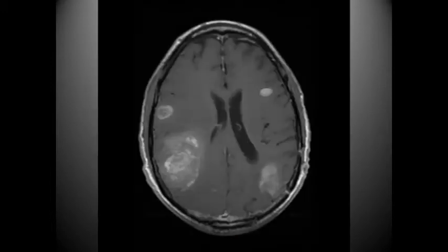Here's another example of brain metastasis with large areas. And another thing that you look for in brain mets, or any kind of cancer that invades the brain, is a midline shift. Now, the midline shift is really easy to determine based on the amount of symmetry that should exist within the brain. What you're looking for is a lack of symmetry, or things being kind of pushed over to one side or the other.